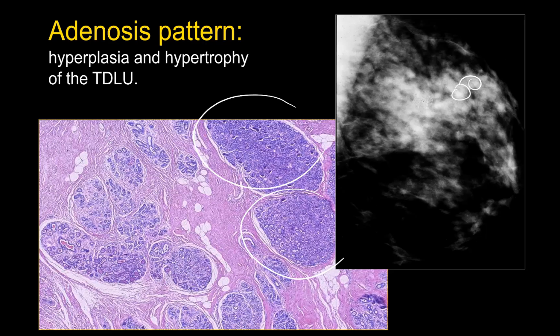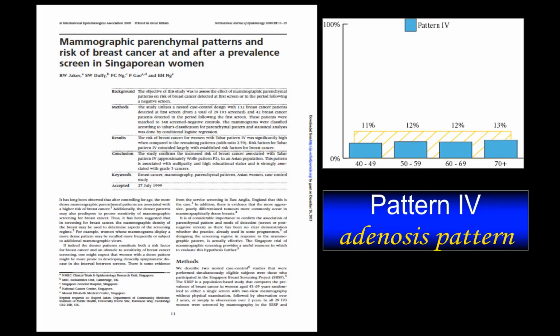And that's important for you to know about, that this is the high-risk patient, but fortunately just 12% of the population has it. So based on those 27,000 cases I classified, we figured out that when she was 45 and when she was 55, 65, 105, it doesn't change.